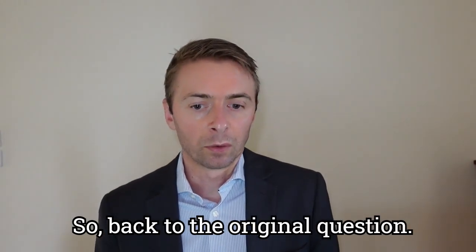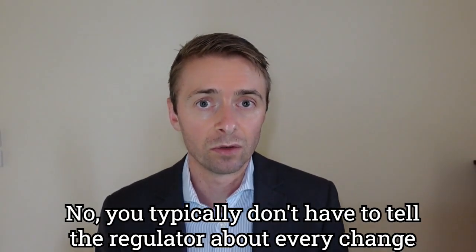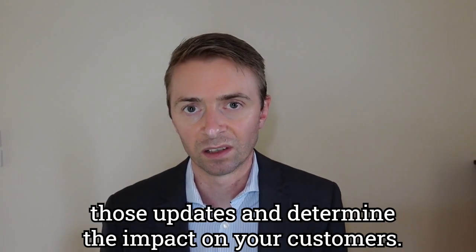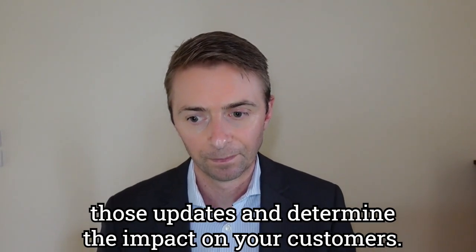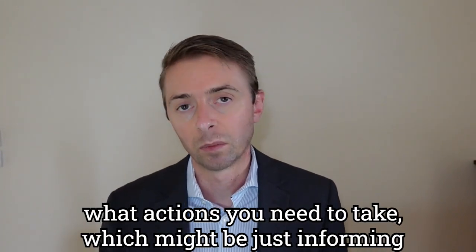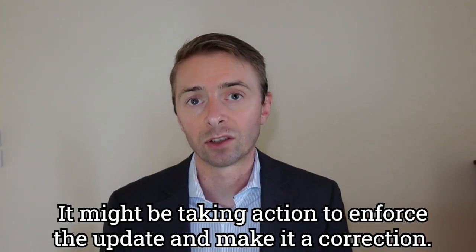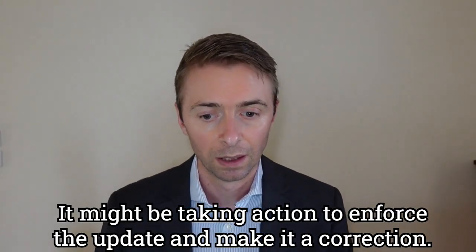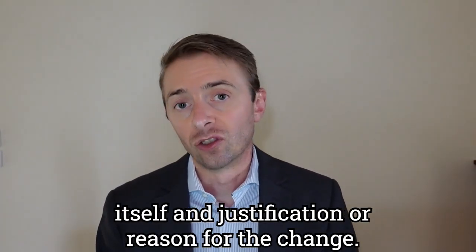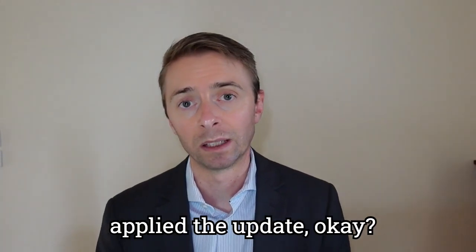So back to the original question, no, you typically don't have to tell the regulator about every change you make to your SaMD product, every update that you push out, but you do need to risk assess those updates and determine the impact on your customers. This should include determining what action you need to take, which might be just informing your customers about the update and the reasons for it. It might be taking action to enforce the update and make it a correction. It almost always involves documenting the change itself and the justification or reason for the change. And it may involve things like tracking how many people applied the update.